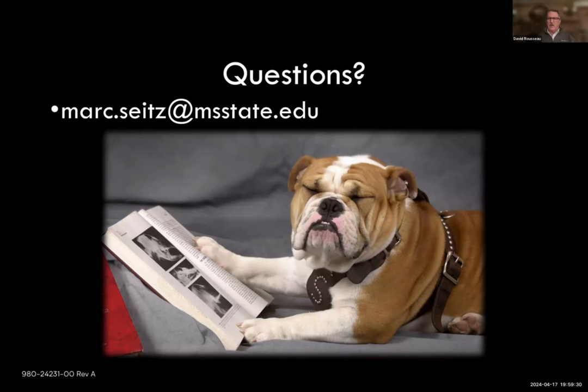All right. Terrific. Casey is asking, would you use this as a pre-diagnostic tool if we see something questionable? So yeah, I think this is what you're asking, as a screening test. Early in my career, I often looked at rads and asked, is that a mass? Or, you're doing your extended point of care and you see a mass that triggers the next step, having that doc come in to do a mobile ultrasound, or whoever does your mobiles. I think that's what you're asking, but if not, please elaborate again.